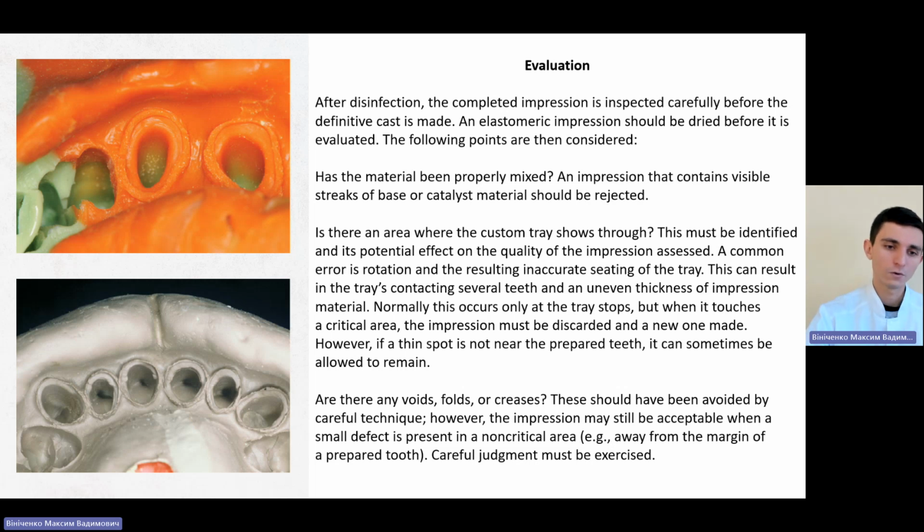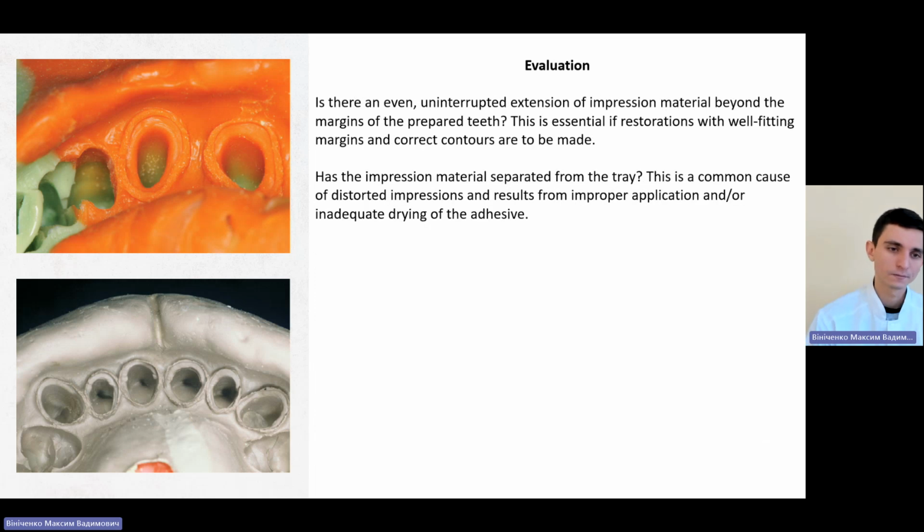Are there any voids, folds, or creases? This should have been avoided by careful technique. However, the impression may still be acceptable when a small defect is present in a non-critical area, away from the margin of a prepared tooth. Careful judgment must be exercised.